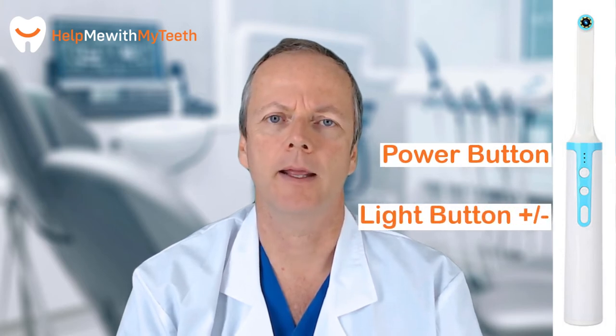An intraoral camera — strange word, many of us have never even heard of that before. What is it? Basically just a web camera on a stick that you can use on your teeth. It's really not that complicated — just a few buttons: a power button, a light button, and a capture button. That's really it.